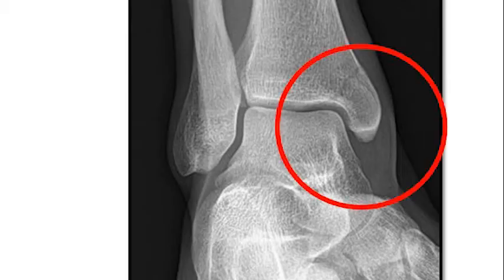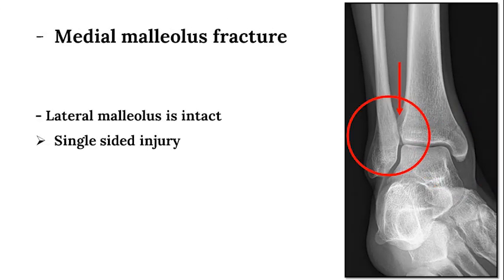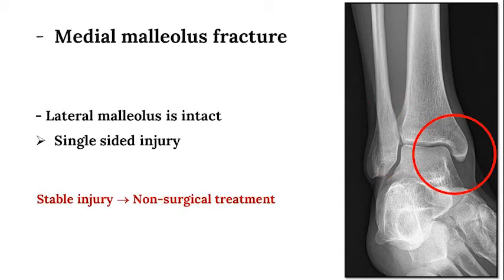This radiograph demonstrates a medial malleolus fracture; the lateral side of this ankle is uninjured. There is no fracture, and the tibiofibular overlap and clear space indicate a stable syndesmosis. Therefore, given the medial-sided injury only, this is a stable injury and can often be treated without surgery.